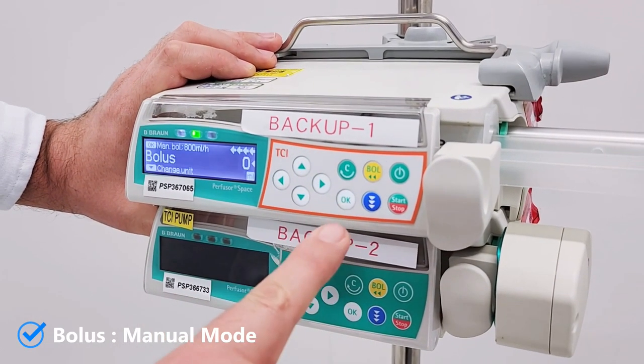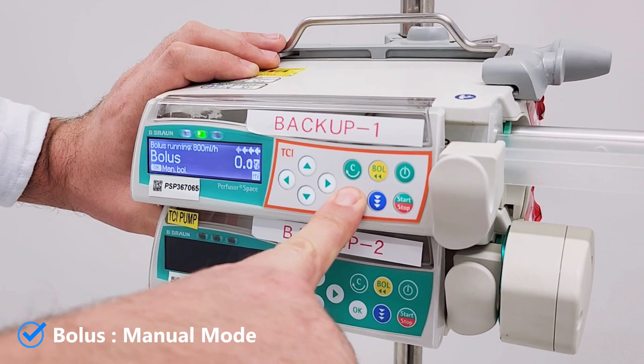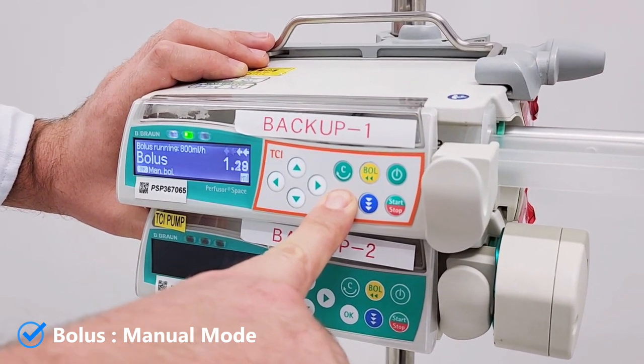Another way is to press bolus, then press and hold the OK button. When the desired amount is reached, release your finger.